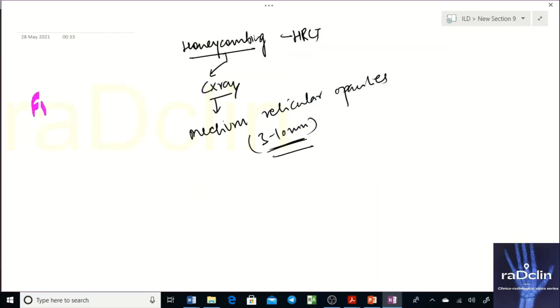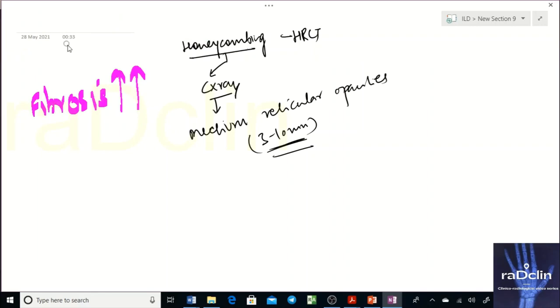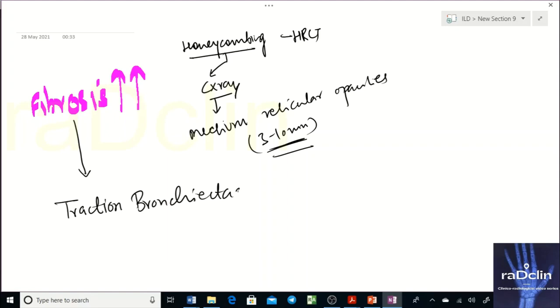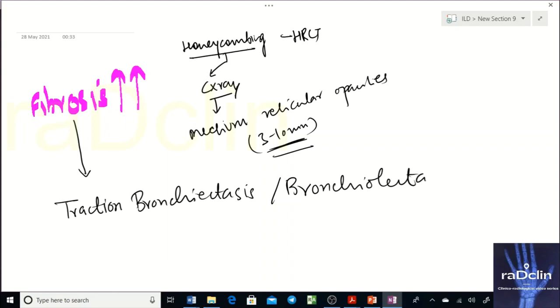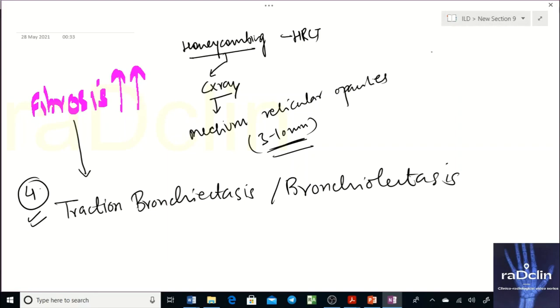Additionally, since fibrosis is there and increasing, traction bronchiectasis or traction bronchiolectasis occurs due to the tethering effect of fibrosis. This is a secondary finding — it will always be present when fibrosis is present. So we have four typical findings in UIP.